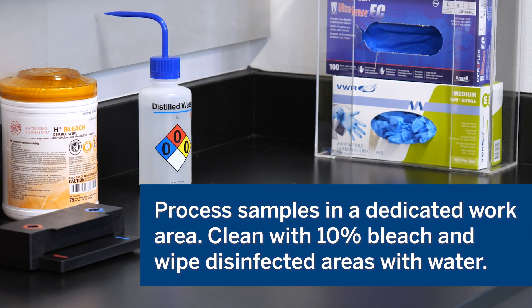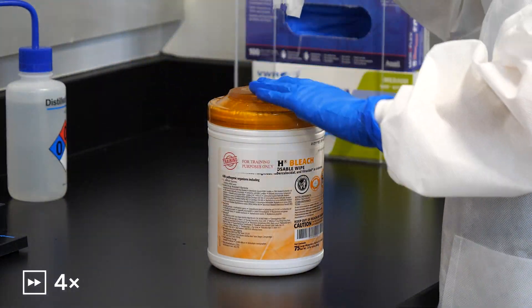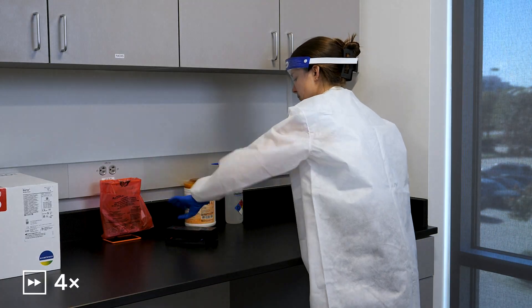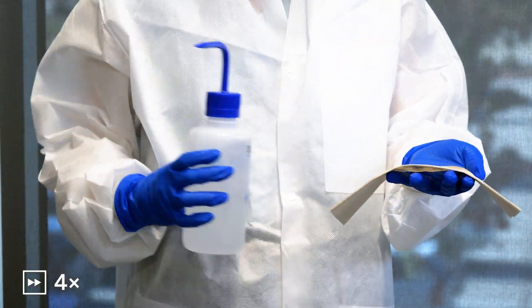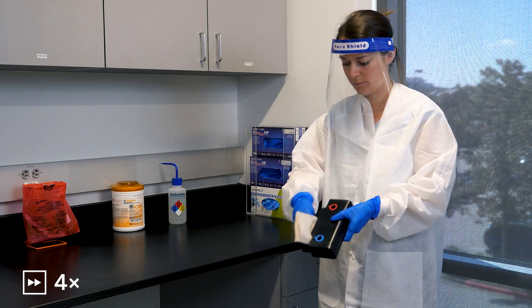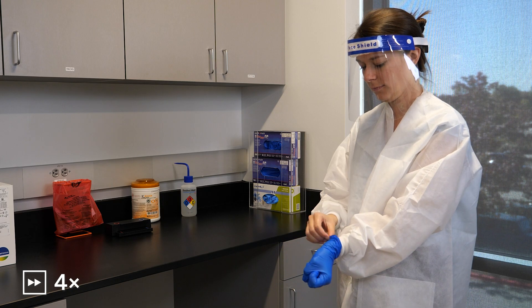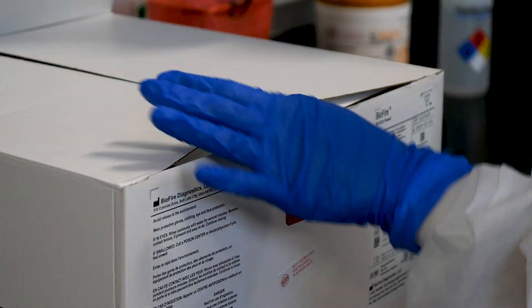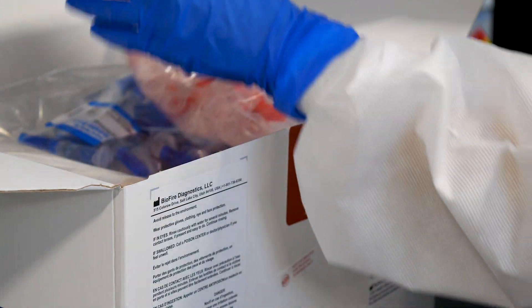Process samples in a dedicated work area. Clean the area and pouch loading station with 10% bleach, and wipe disinfected areas with water. Handle samples one at a time, always changing gloves between samples. Use clean gloves when removing reagents from bulk packaging bags, and reseal bulk packaging bags when not in use.